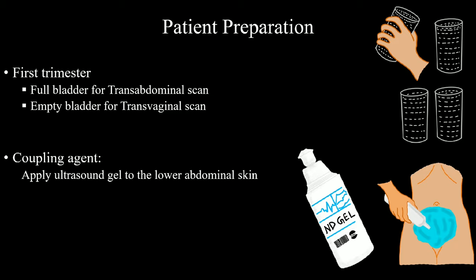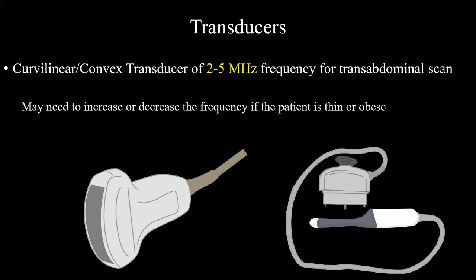Now apply ultrasound gel over the lower abdominal skin. For the transducer, we'll go for the low-frequency curvilinear probe. We use 2–5 MHz frequencies, but you should change the frequency and choose a suitable one which will make the organs well visualized. We usually increase the frequency for thin patients and decrease for obese ones. If you want to do a transvaginal scan, use a high-frequency TVS probe. TVS is the best tool for early pregnancy evaluation.